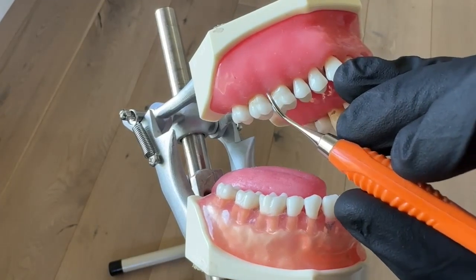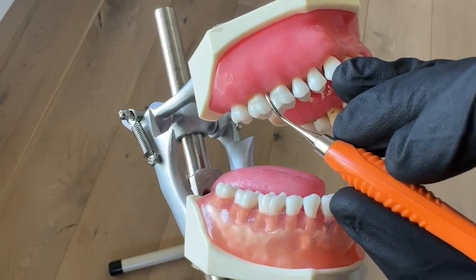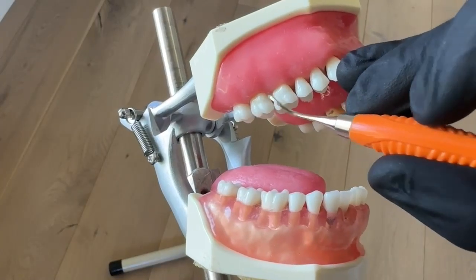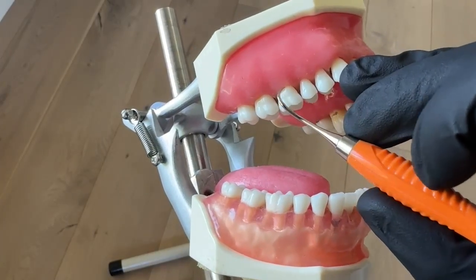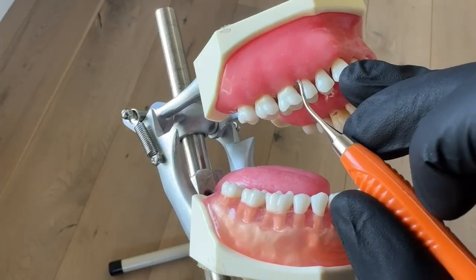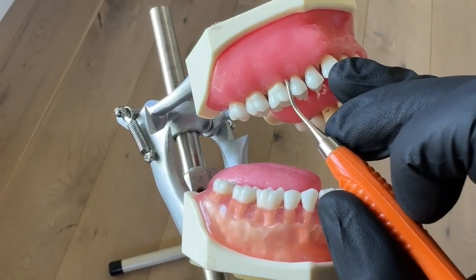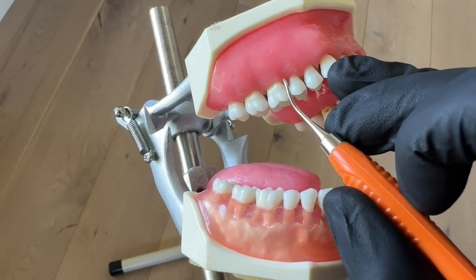Start first by making sure you can feel that the tooth is adapted, then make your 70-degree angle and do your calculus removal stroke. Go super slow when you're first learning — it's all muscle memory. Stop, make sure you're adapted correctly, now make your 70, now do your calculus removal stroke to remove what's under there.